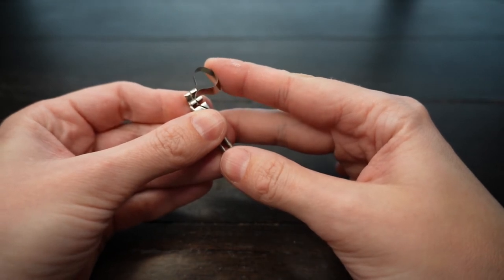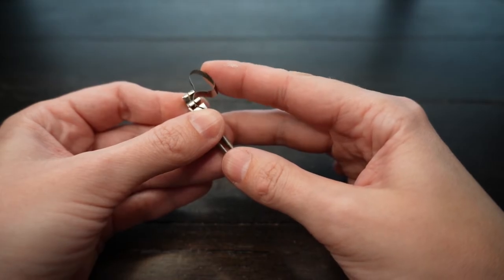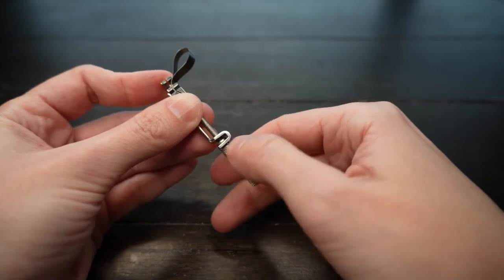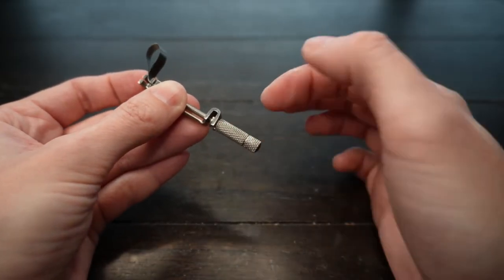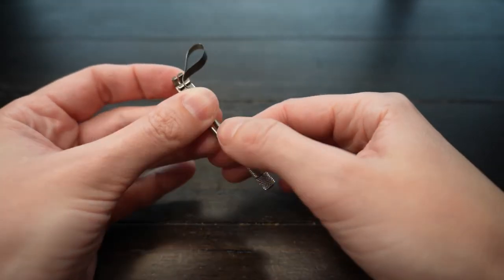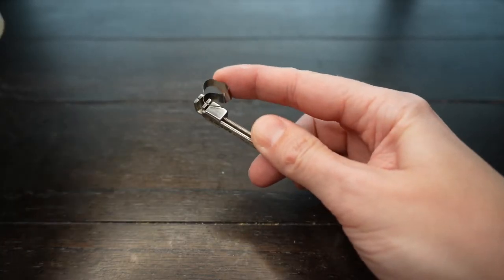In my case, as I mentioned, I'm gonna work on the lower left molar. So I would prefer it a little bit larger, so it'll be easier for me to place the band. So I go counterclockwise with this screw to adjust the size. I went counterclockwise all the way and the band became pretty large in size.